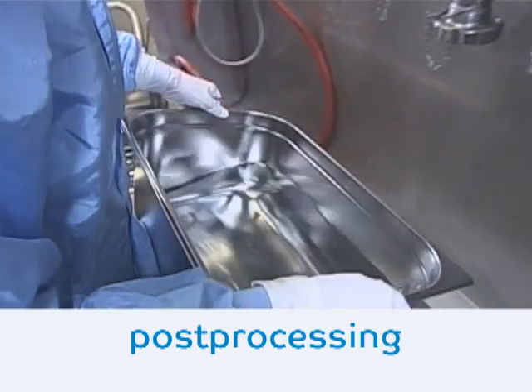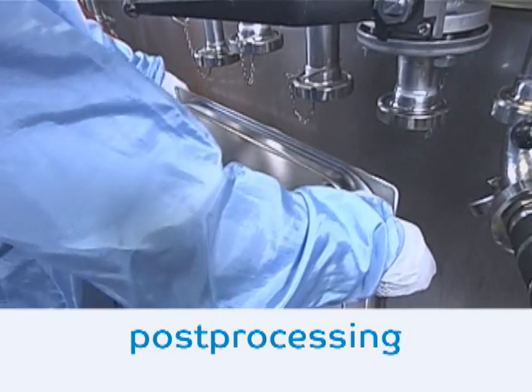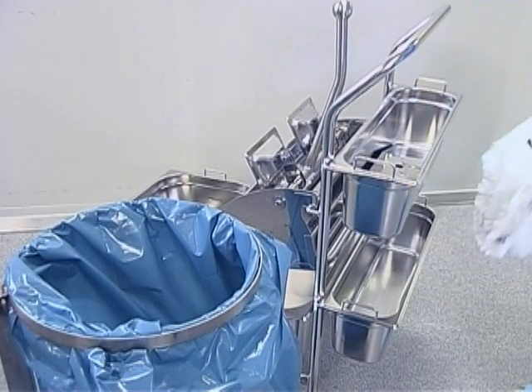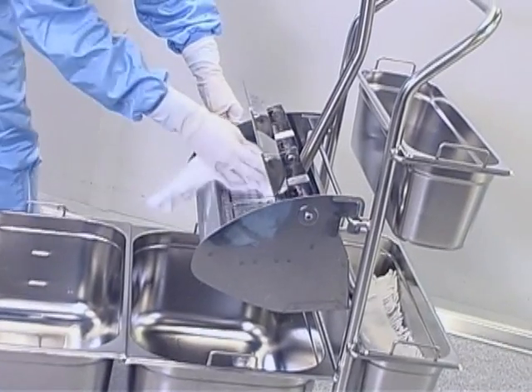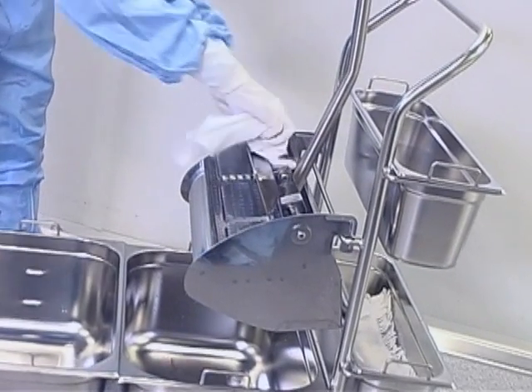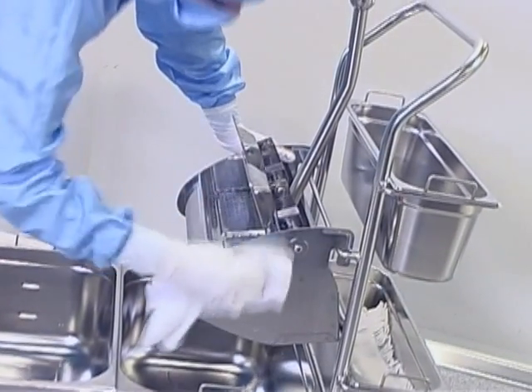After completion of the work, all buckets are emptied completely and the in-use solution gets disposed of. Used mop heads are collected in the prescribed laundry bag and washed immediately. Residual water is removed from the buckets and water droplets are removed from the trolley. All parts are then dried with a dry wipe to prevent residue formation.